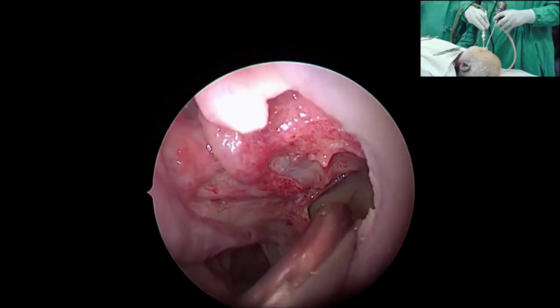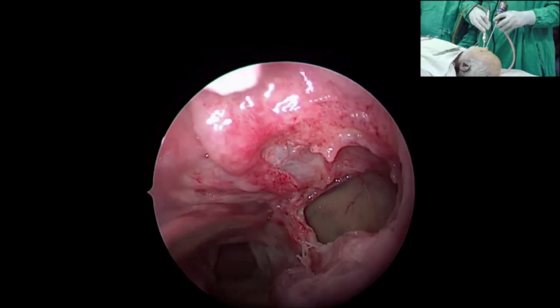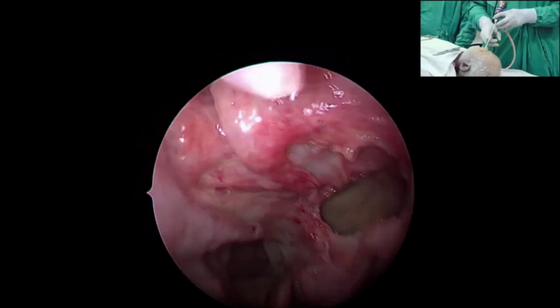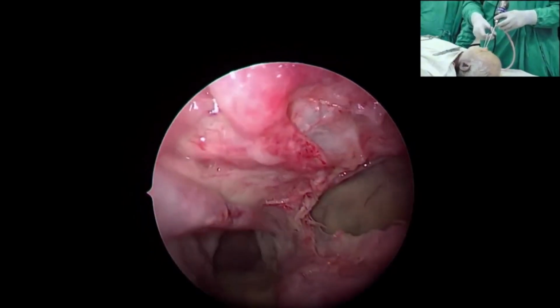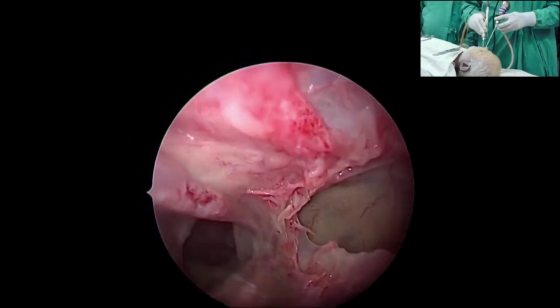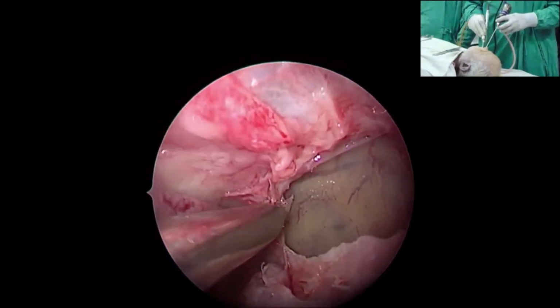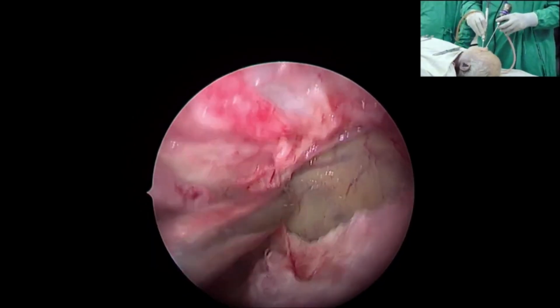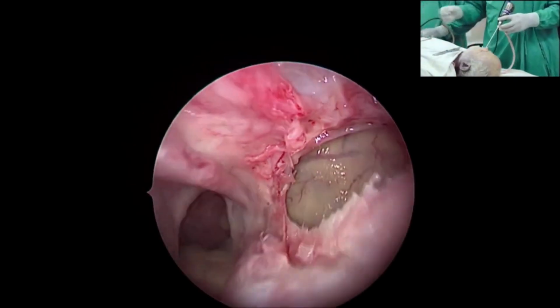Or if you want further surveillance and gravitational drainage, like many a time we do for tumors, we can do a complete medial maxillectomy, so that the entire maxillary sinus can be marsupialized to the floor of the nose or nasal cavity. So a variety of middle meatal antrostomies can be accomplished according to the need for the indications you are doing for, and that's how we should be able to do all this. So you can enlarge according to the need.